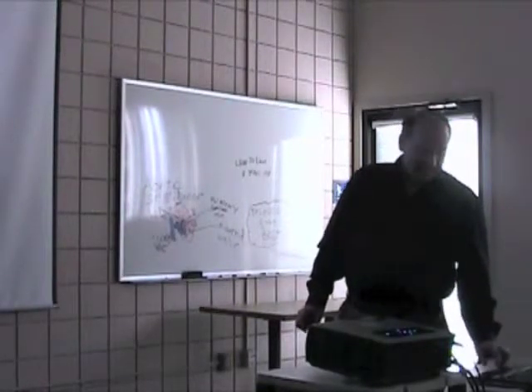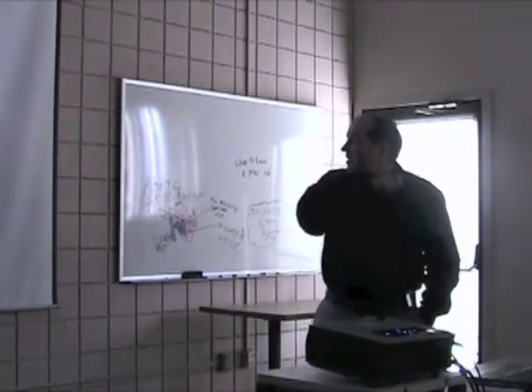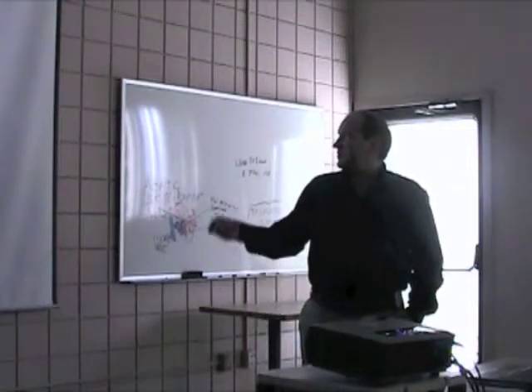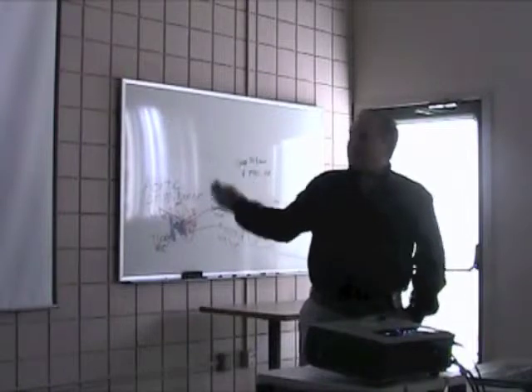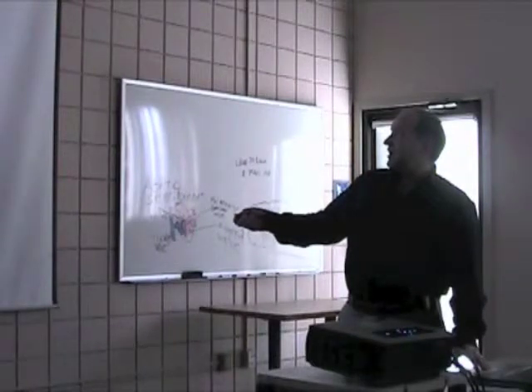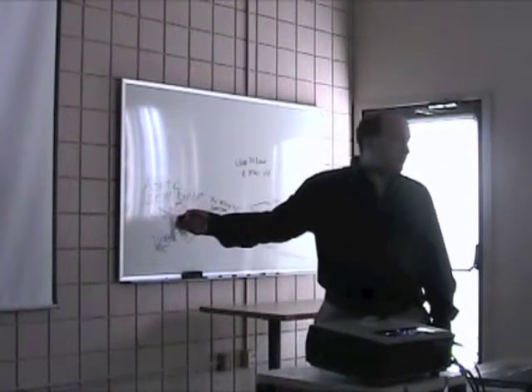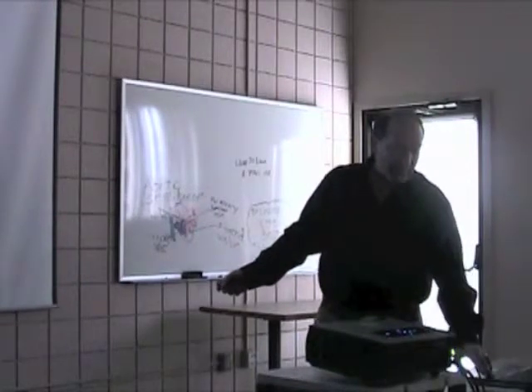This is a stentless valve that I just showed you. And this is actually, I think, a pig heart that was put through that same preparation, but this looks amazingly like a normal human valve. That's the papillary muscles inside the heart. But you can see these are sutures here where those coronary arteries were. And if you didn't see those sutures in this cloth over here, there'd be no way to tell that wasn't a human valve. So the stentless valves really are good.